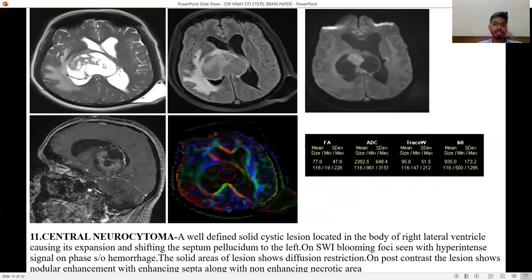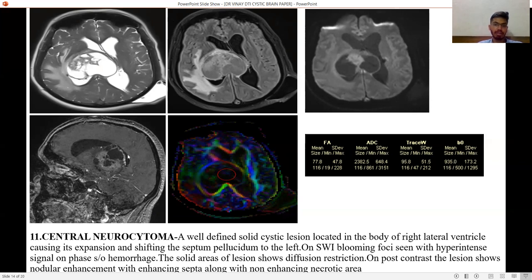Central neurocytoma — a well-defined cystic lesion located in the body of the right lateral ventricle, causing its expansion and shifting the septum pellucidum to the left. On SWI images it shows blooming with hyperintense signal on phase, suggestive of hemorrhage. The solid areas of the lesion show diffusion restriction. On post-contrast, the lesion shows nodular enhancement with enhancing septa and a non-enhancing necrotic area within.